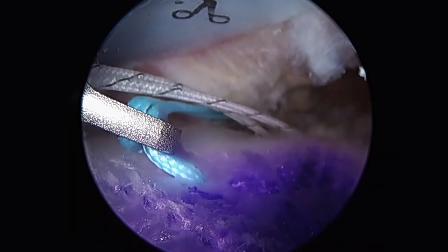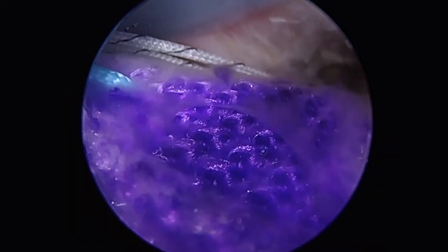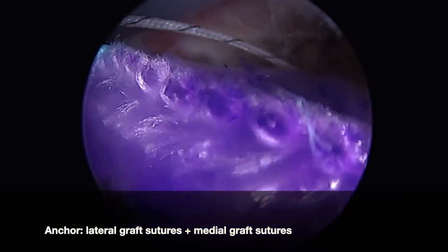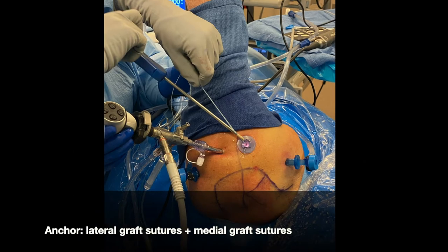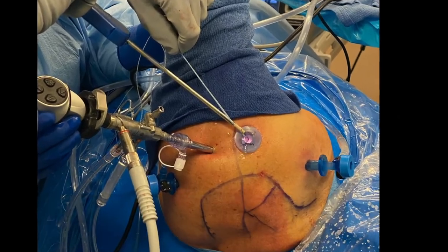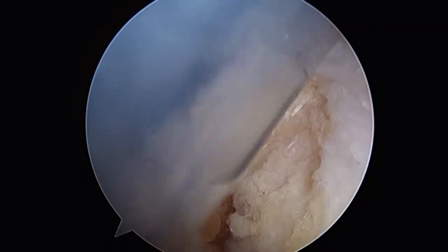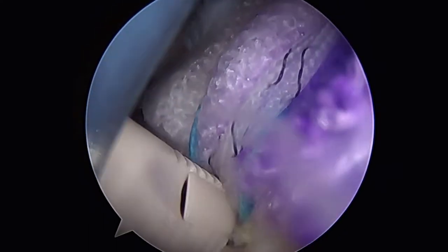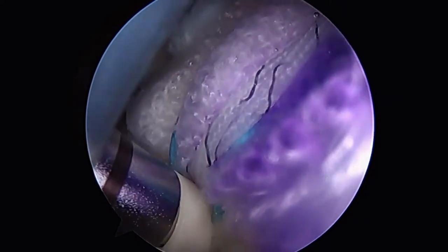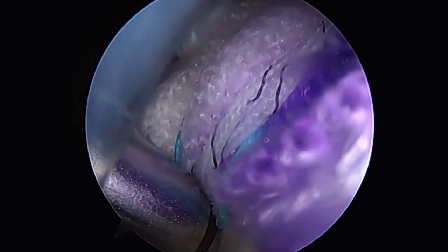Now we're ready for lateral fixation. We'll select one set of the graft's lateral sutures as well as two of its medial sutures. Outside the body we'll load all four sutures into a knotless lateral row anchor. The anchor is then deployed in standard fashion, compressing the supraspinatus down to bone as well as the graft down to the supraspinatus and the bone.